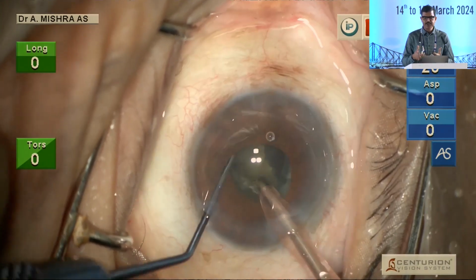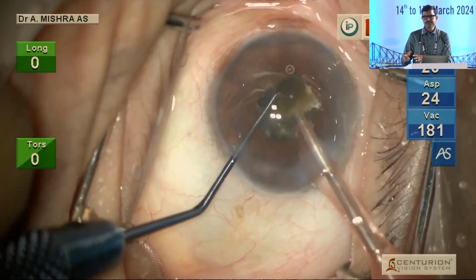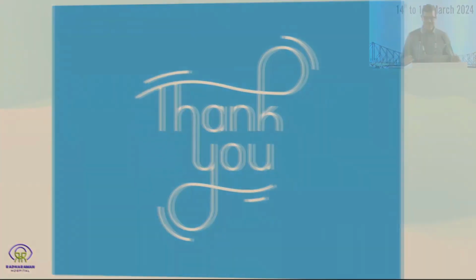This is an unedited video, and I just wanted to show you that it's not very difficult to manage the nuclei, even in the presence of hard nuclei, in the majority proportion of our cases. So whenever we can, we should. Thank you so much for the opportunity again.